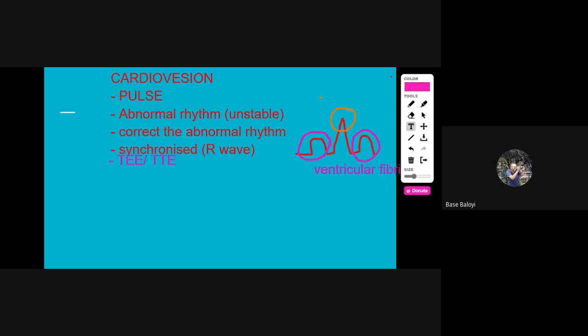These are done to rule out clots, right? Because cardioversion cannot be done if there are clots. So what I'm trying to tell you is, if there are clots, no cardioversion.